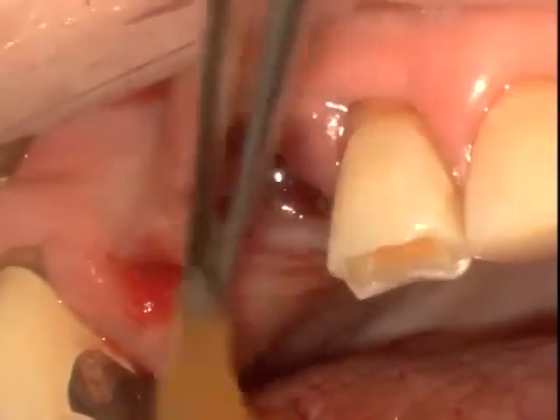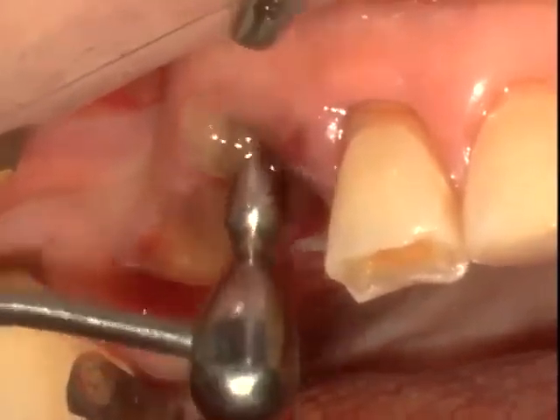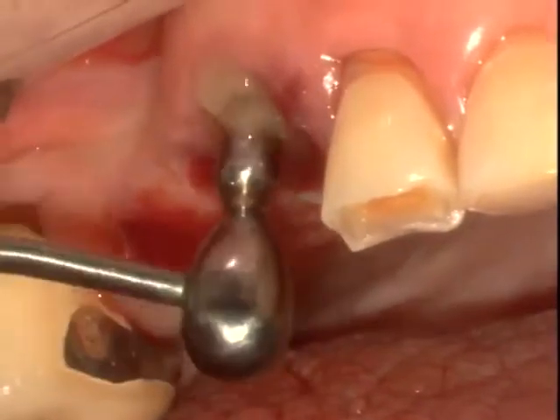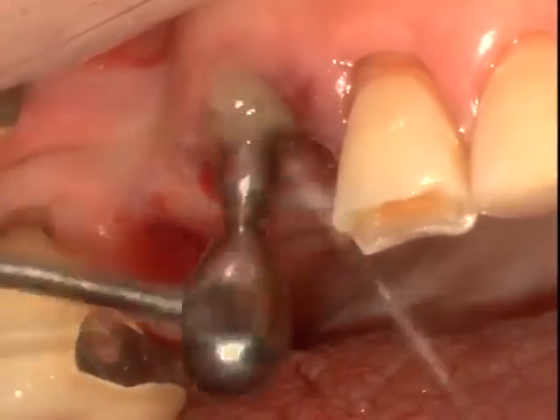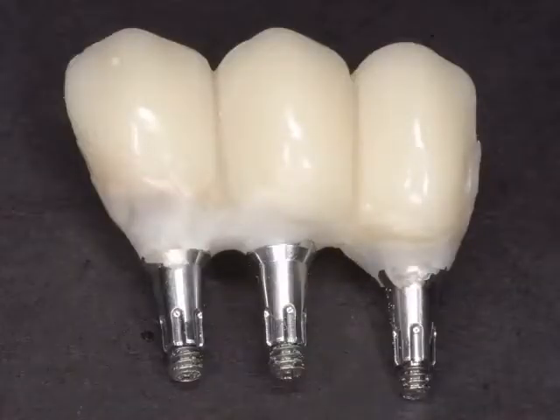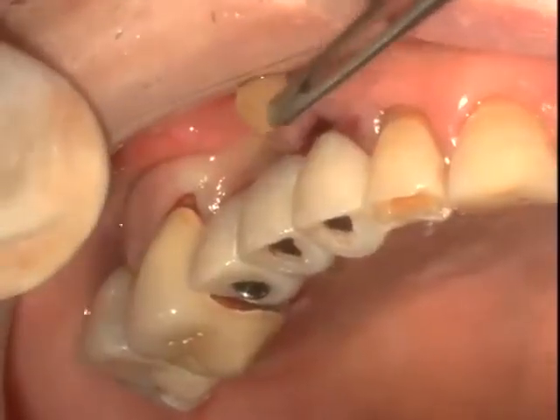We place a little bit of the PRGF fluid into that area and a little bit of a fibrin plug to seal off that area. Acts much like a short-term autologous barrier membrane that is obviously impregnated with autologous growth factors. This is now backfilled and then reshaped in the laboratory. You can see the CX precise connection fits onto those carrier assemblies.